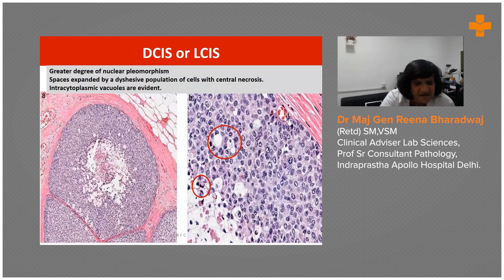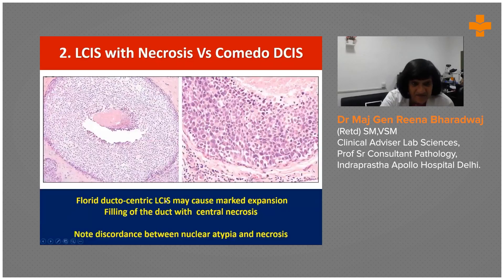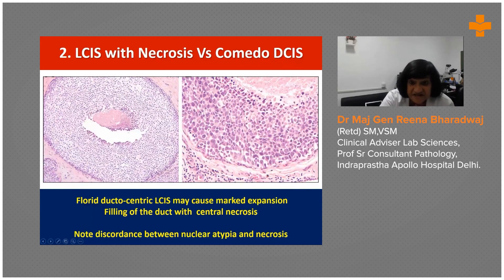Look at the shape, size — put all the features together. Discohesiveness, cells trying to run away from neighbors, then consider all the features. Now look at these two: this is such a monomorphic population, while here the cells are much larger, more pleomorphic, angulated — they are not running away from each other, they are sticking to each other. So this is a comedo DCIS while this is an LCIS with necrosis.